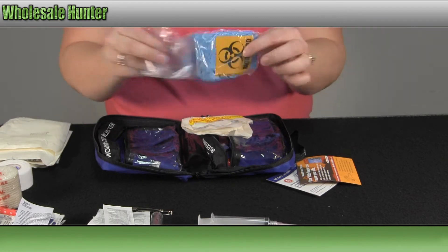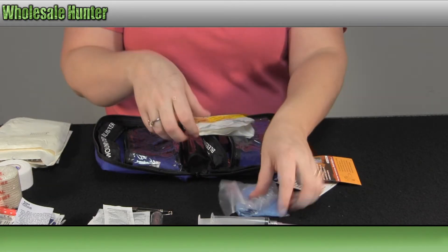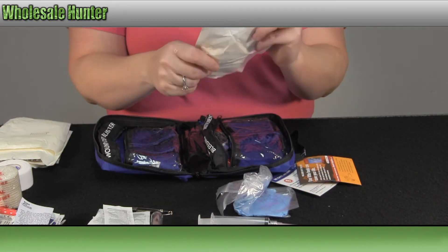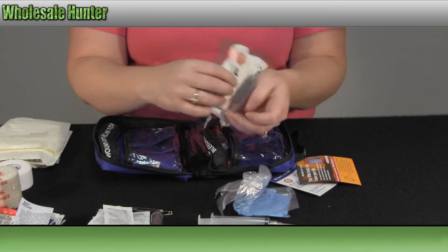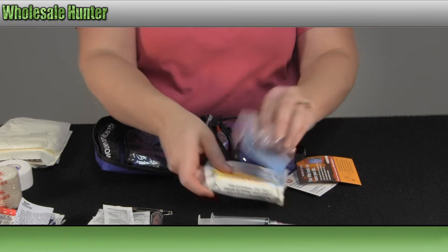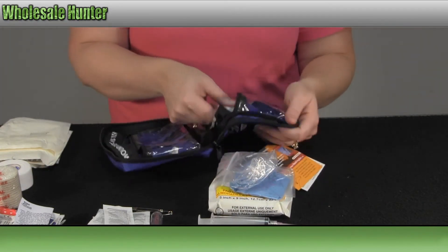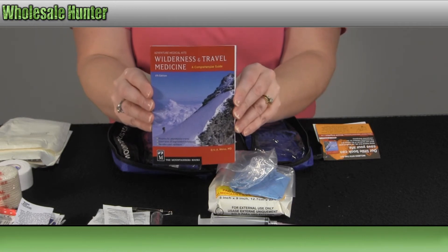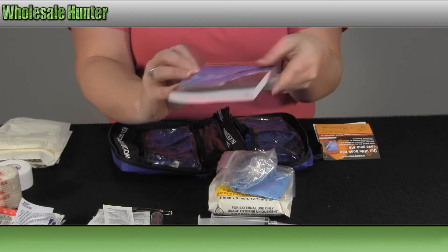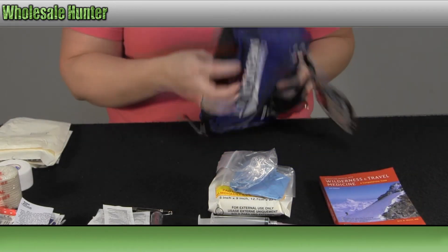You have your protective gloves, a 5x9 combination pad, and a wilderness and travel medicine guide.